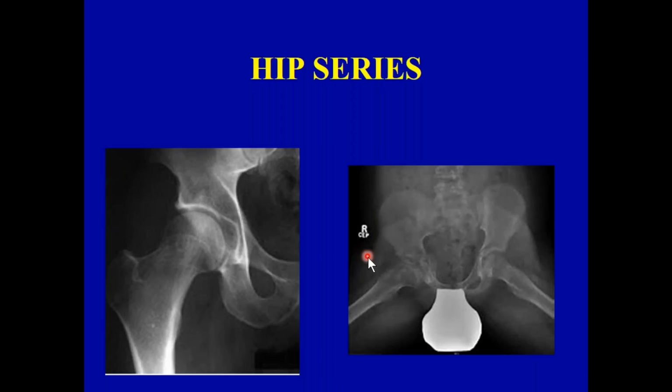Well, they didn't. Not only did they not use a gonadal shield, they didn't give her the same metal draping device that you get at a dentist. So what happens when you go to the dentist, if they decide x-rays are needed, you get a shield from thyroid cartilage all the way down, because they're aware of the adverse reactions or consequences of radiation. So if you have gonadal shielding, now's the time to use it on your hip x-ray.